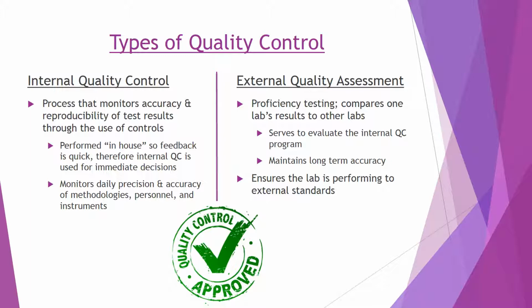On the other hand, your external quality assessment refers to required proficiency testing. And ultimately, that compares one lab's results to other labs. Proficiency testing serves to evaluate the overall internal QC program, and it maintains long-term accuracy. So it's not that quick turnaround like your internal QC. And it also is going to ensure the lab is performing to those external standards.